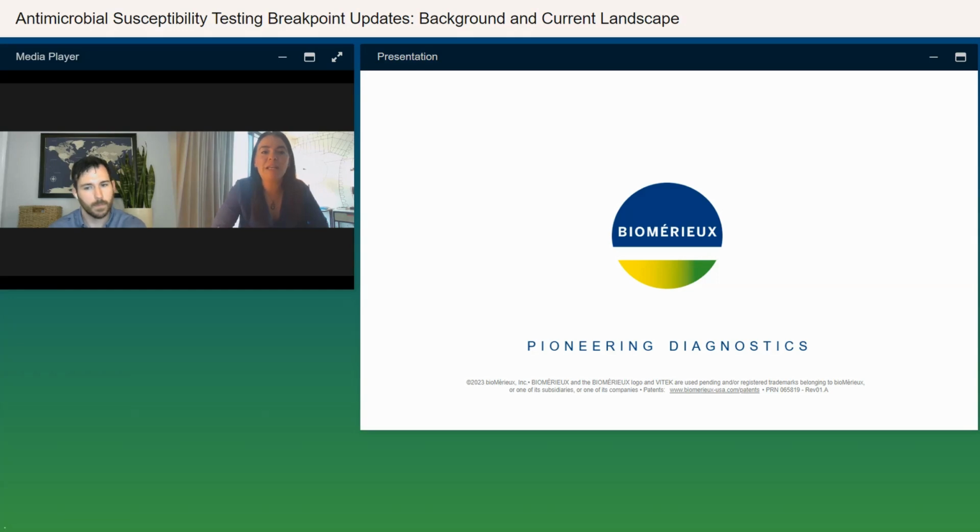This does bring up a good point. Breakpoint updates don't only apply to automated susceptibility test systems. They do apply for manual methods as well. So reviewing all of the breakpoints that you're using across your methods is important.